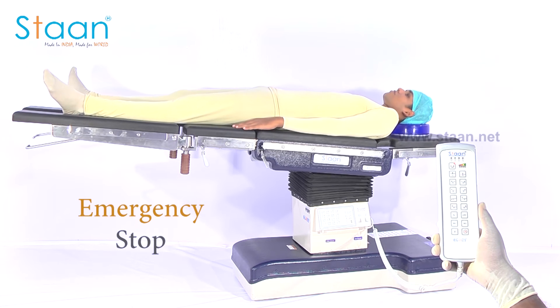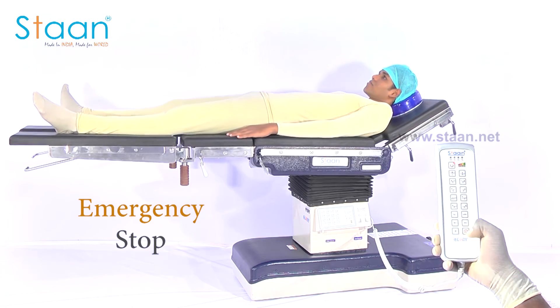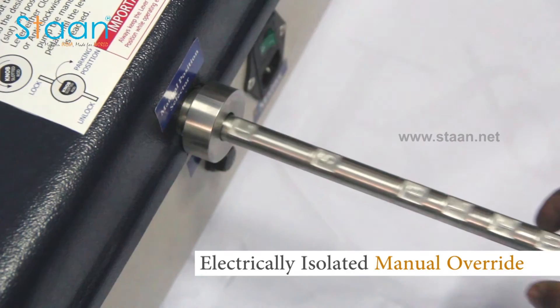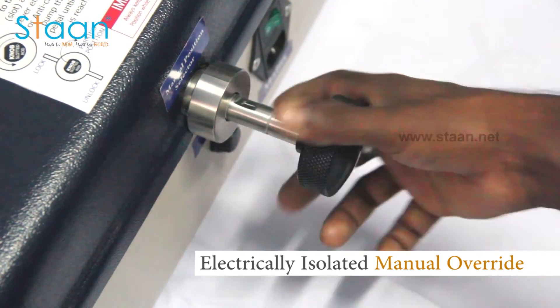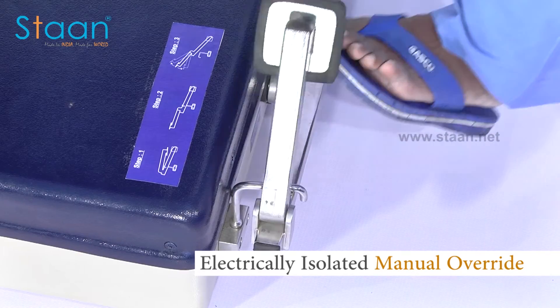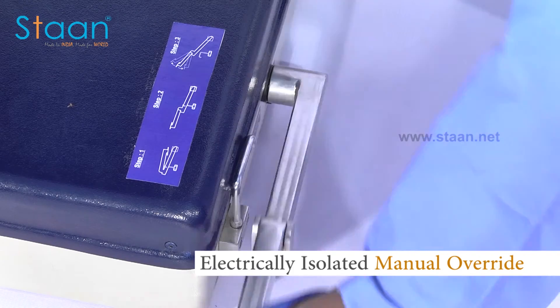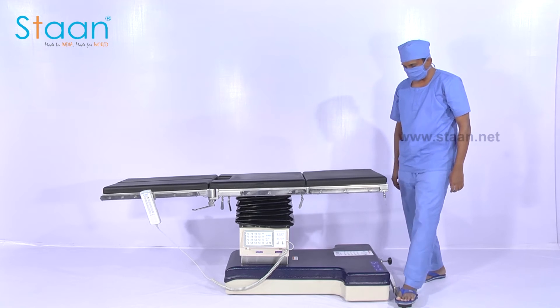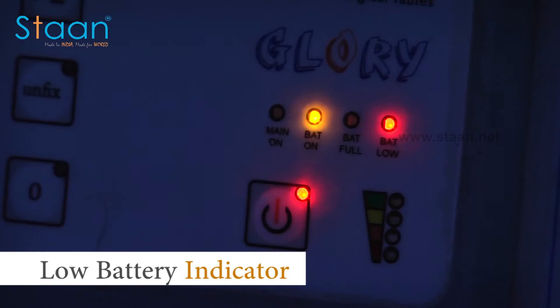An emergency stop feature can hold the table in case of emergency. The device can also be operated manually by a foot pedal in case of power failure. Designed with huge battery backup with status indicator in the remote.